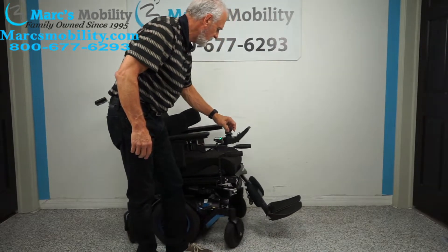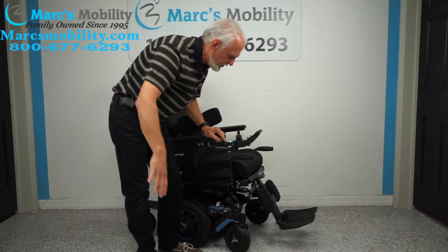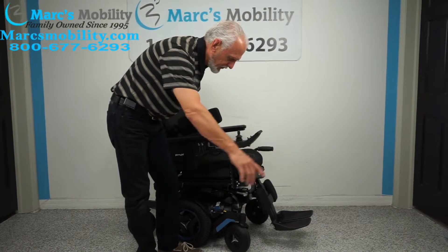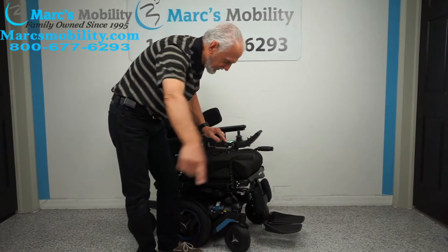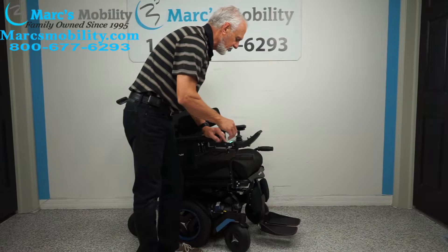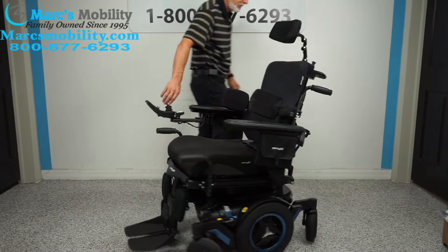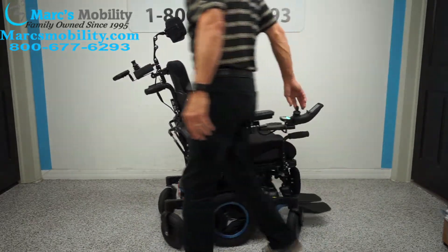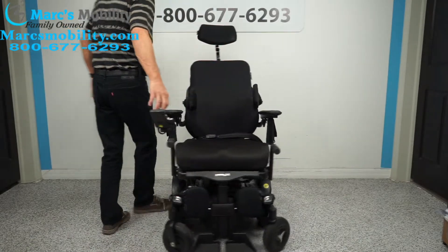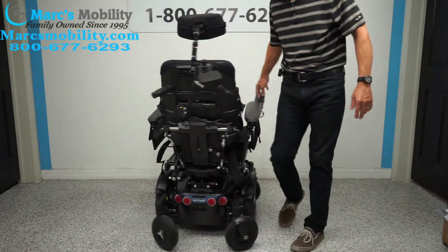Let me show you how well this chair turns in your house. If you're indoors, you want the legs all the way in to get the best turning radius. With the legs all the way in, look at this — I can't even hear this chair it's so quiet. You can turn this chair in its own length, right in this one spot.